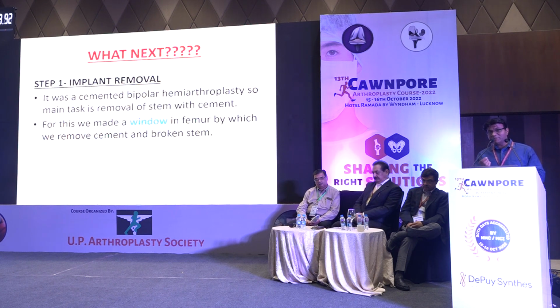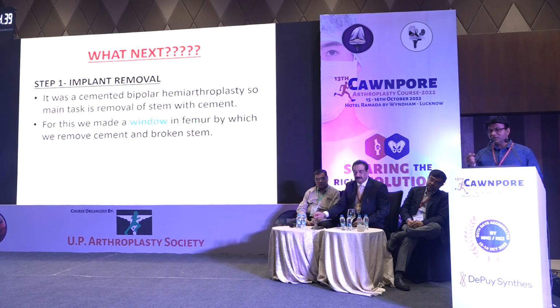And in this case particularly, I made a mistake. I was somewhat lethargic. I started my extraction, extracted the proximal part of the implant, and I thought that it would be removed easily. So there was a little bit of perforation in the lateral cortex. So I immediately changed the plan: have a wide exposure.